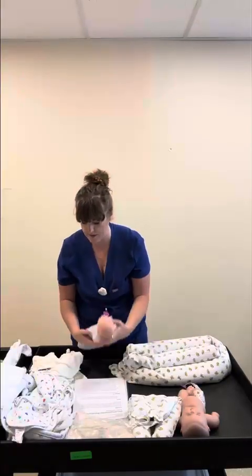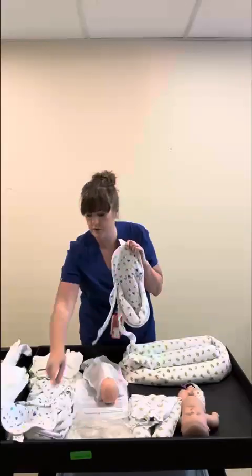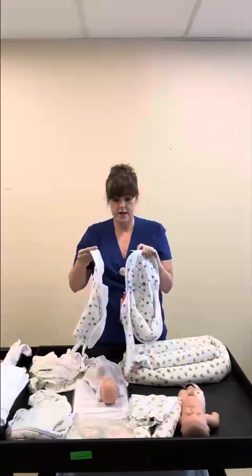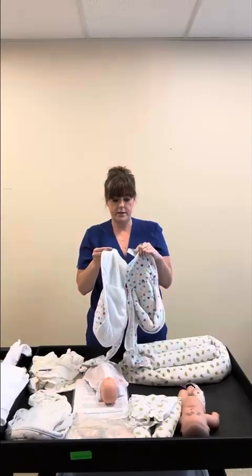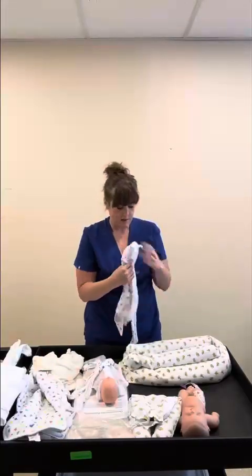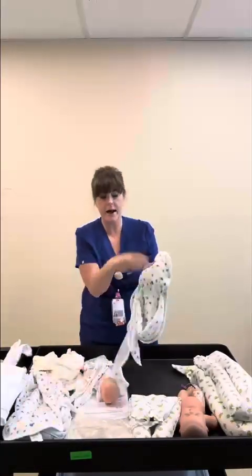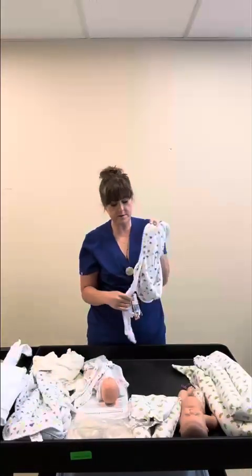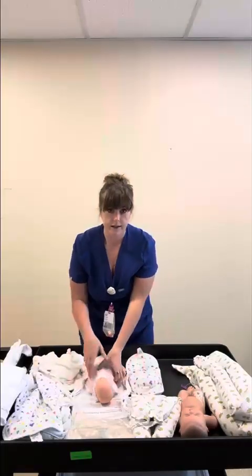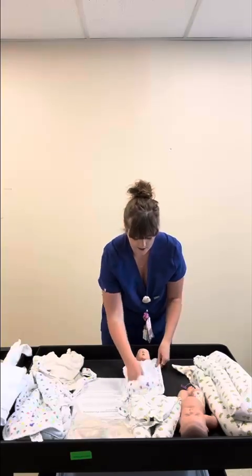So supine, this baby is really small. We've got these products back in. These are called snuggle ups. We have 2 different sizes of snuggle ups, smaller and larger. One's actually like a small, one's a medium. But for this baby, we're going to use the small snuggle up. It works a little different than the Dandle 2 in that it doesn't have a swaddling capability. While this baby's on phototherapy, you do want to maximize skin contact with the light. And so you will place this baby's feet into this little barrier.